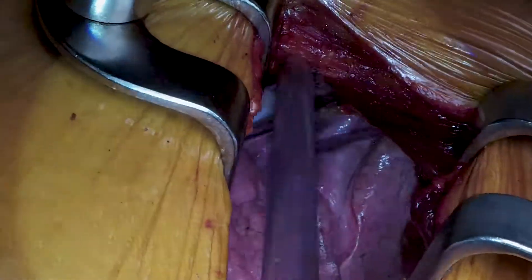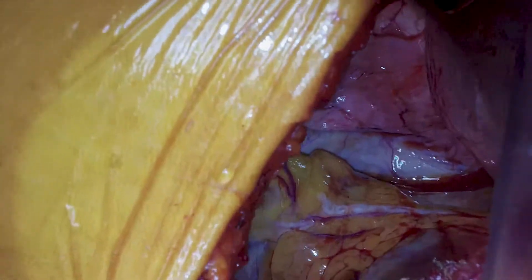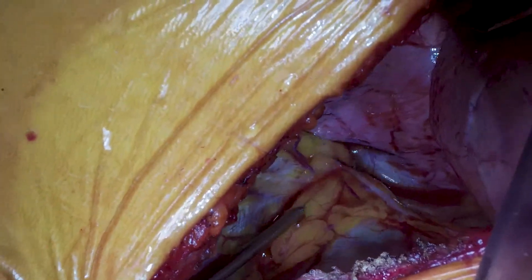As well as injecting the local anaesthetic in the intercostal space, it's also a good idea to inject some into the phrenic nerve to help with shoulder tip pain, and into the vagus to reduce cough. What Mr. Dunning is doing here is injecting it into the phrenic, which you can see closer to the diaphragm, trying to stay away from the pericardium so that it is a safe procedure.